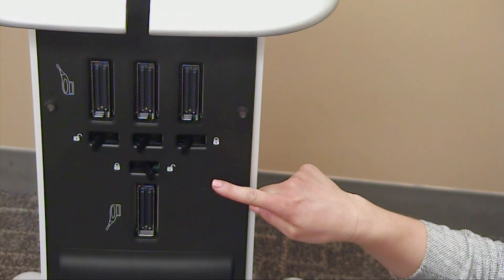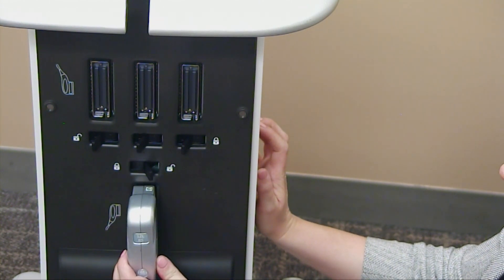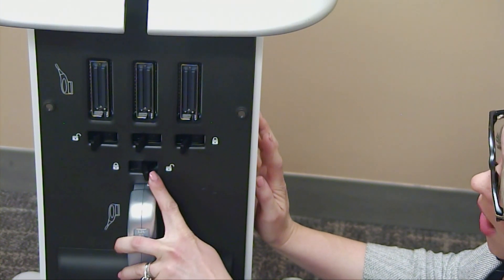There are four probe ports located on the back of the Venue. To lock in your probe, slide your probe into the port and push your lever towards the lock icon.